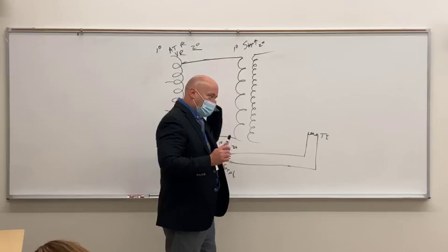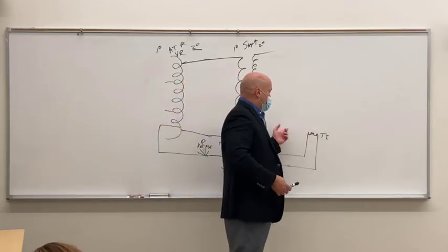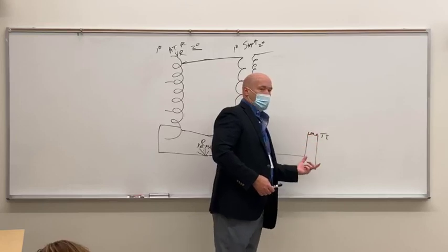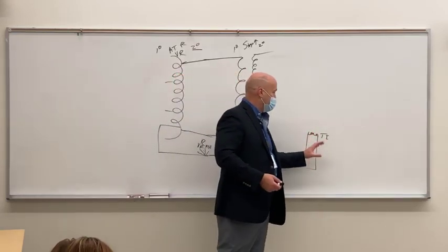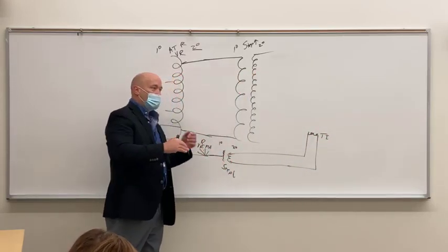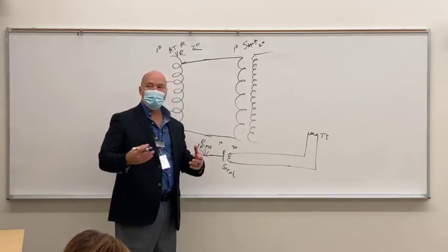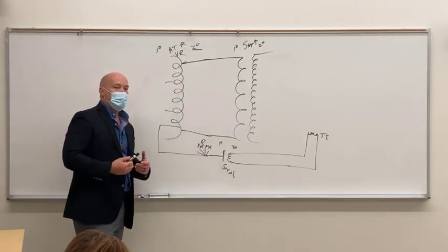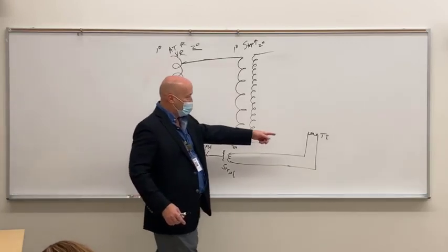Now, here's one thing that we didn't really talk about, and that is that you've always got a filament current running. It's not until you press the prep button that this thing heats up to the point of thermionic emissions. The reason we've always got a filament current running through the filament circuit is because the main thing that kills an X-ray tube is heat, right? And it comes from a lot of different directions. We create a lot of heat.